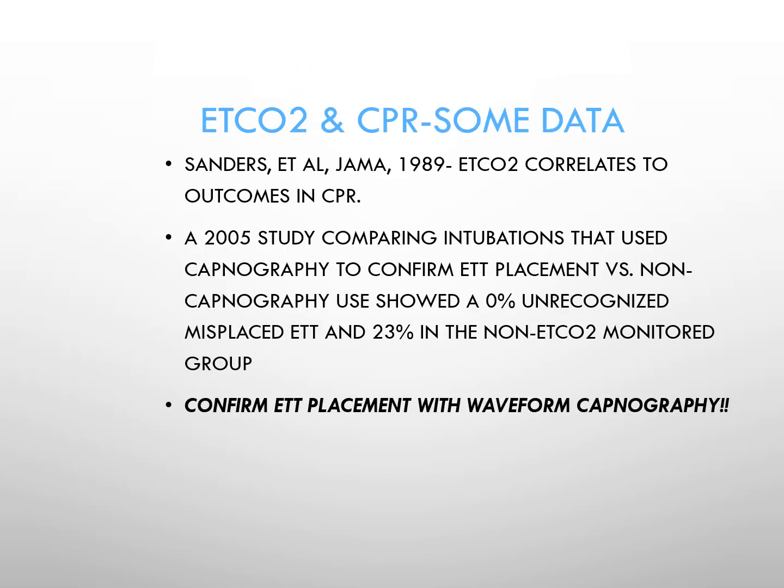Some of the additional research that's been done was published, for example, by Sanders in the Journal of the American Medical Association in 1989, where these researchers determined that end-tidal CO2 correlates to outcomes in CPR. And I'll discuss some of those thresholds in subsequent slides.